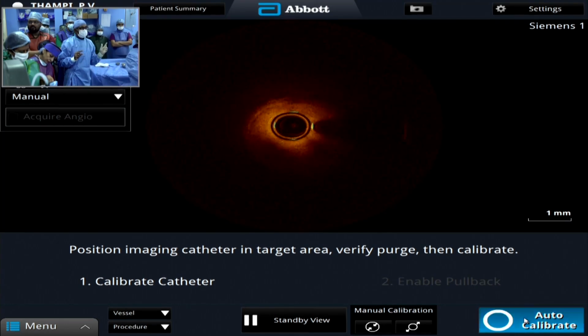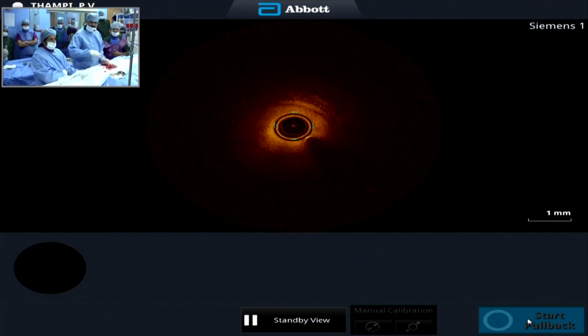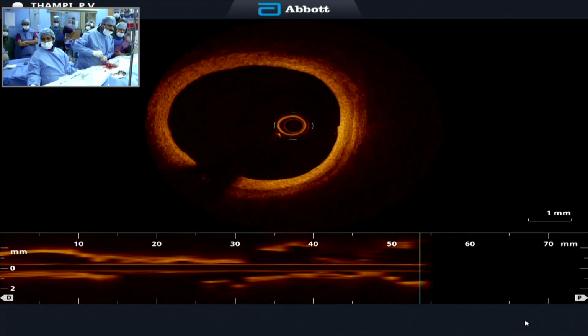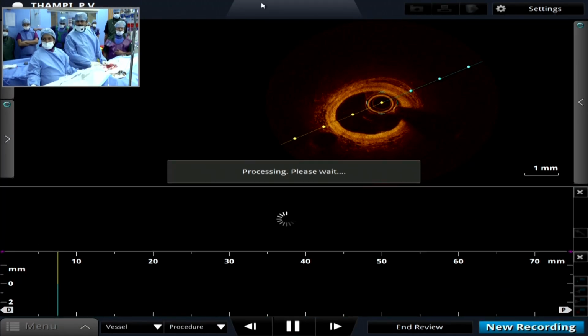What a clip. Enable pull back. Yeah. Seriously. Yeah, we have it on the shelf. Today we would want to use Activate. Catheter edukam. I'll come that side.